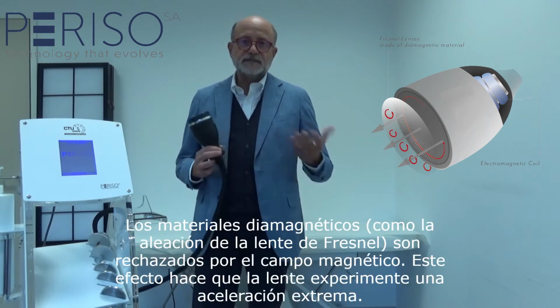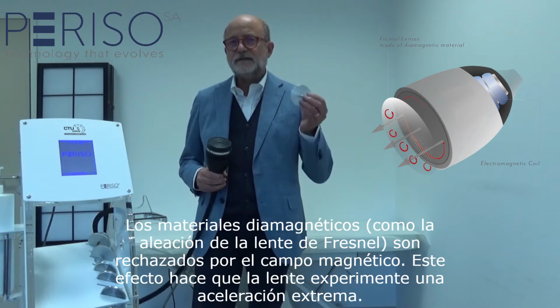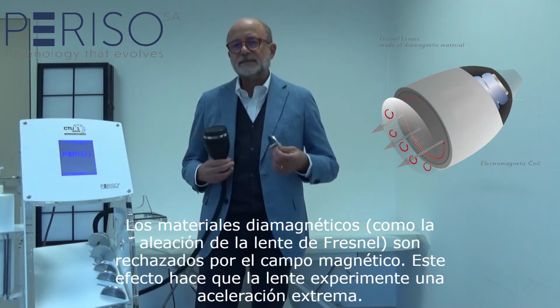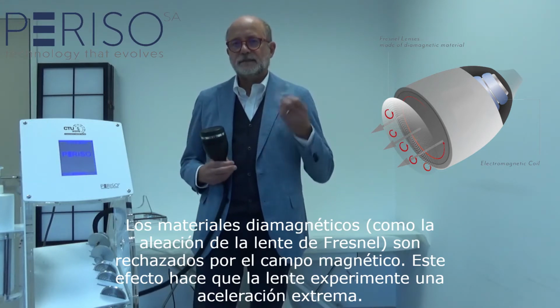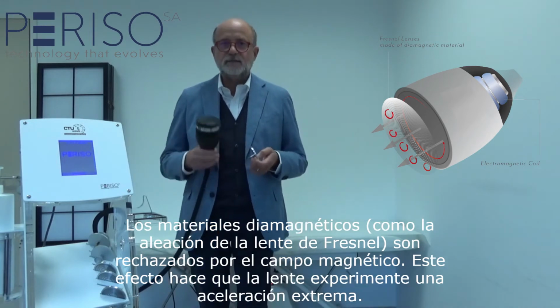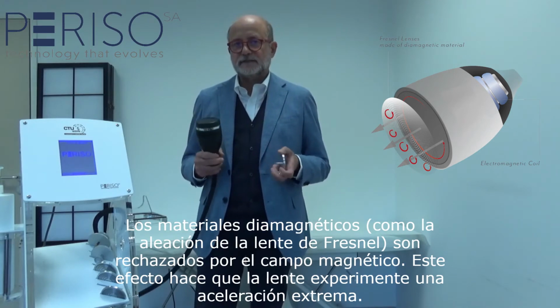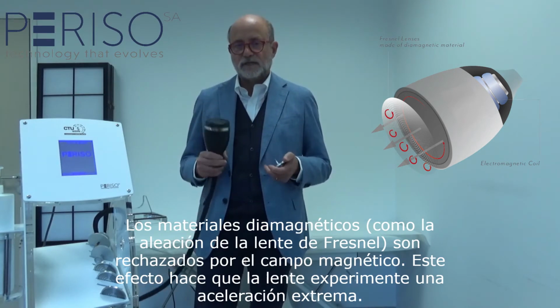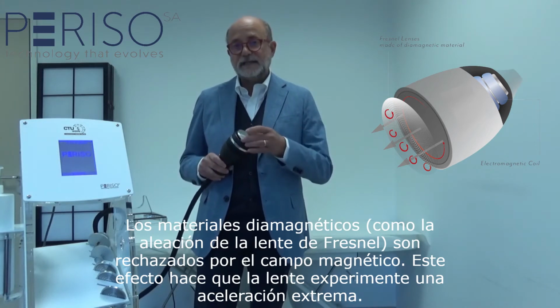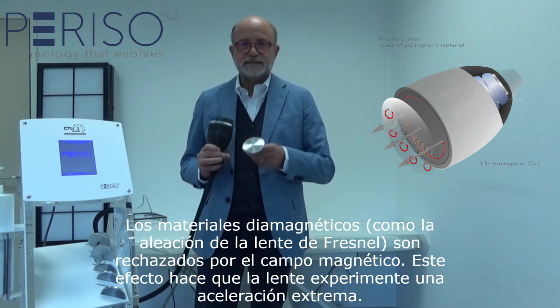From the principles of physics, if we have diamagnetic materials, and diamagnetic materials are materials that are repulsive to the magnetic flow, then when I have a pulsing high intensity electromagnetic field and this flow of the magnetic field meets a diamagnetic material, we have a movement of the lens.